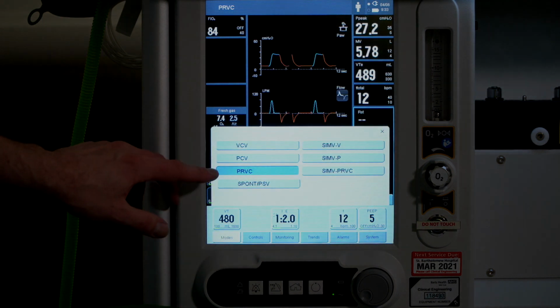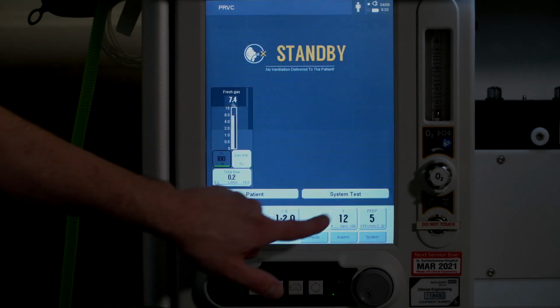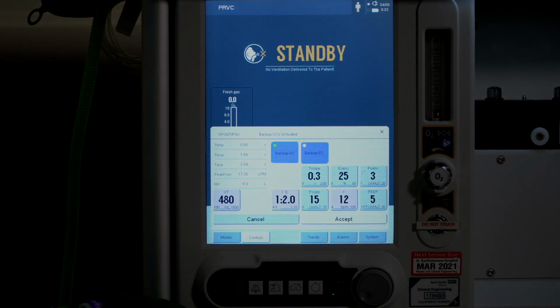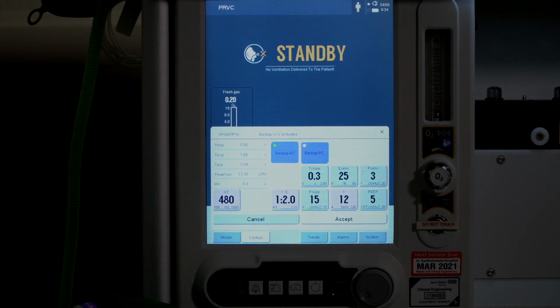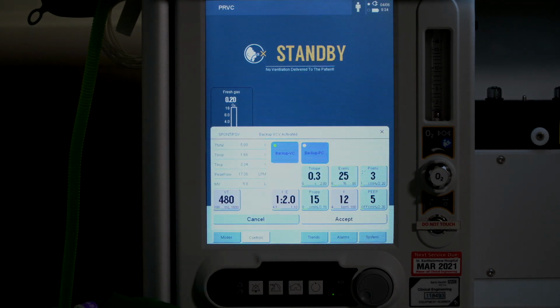I'm going to move now to pressure support. I'm going to pause the ventilator to do this. And you'll see here that you get the option to choose what your backup mode is. So you can see you can have backup volume control or backup pressure control. And again, the numbers in pink are the things that you can manipulate related to that mode. The rest of it is pretty familiar to us, so you can set your pressure support value. Your slope and your e-sense are happy as default, so there's no need to adjust those.